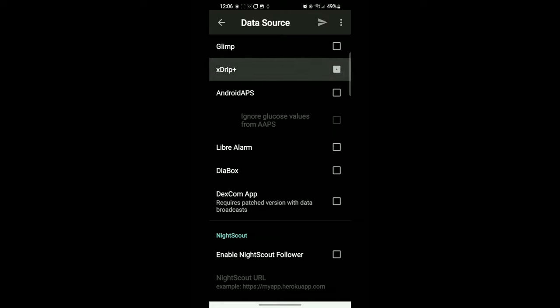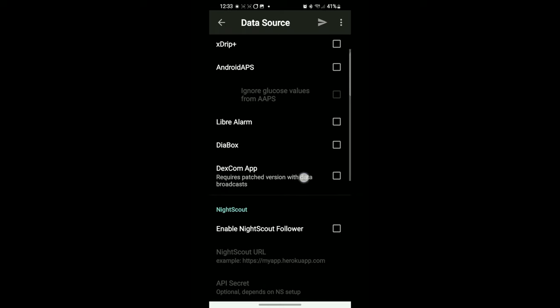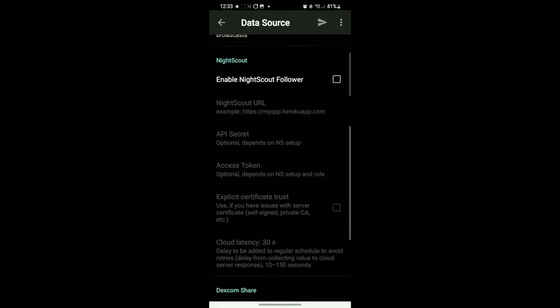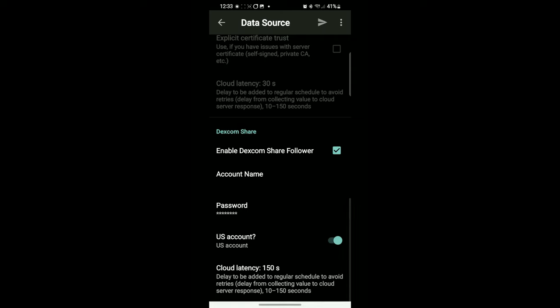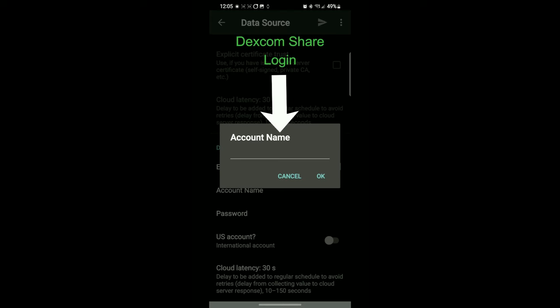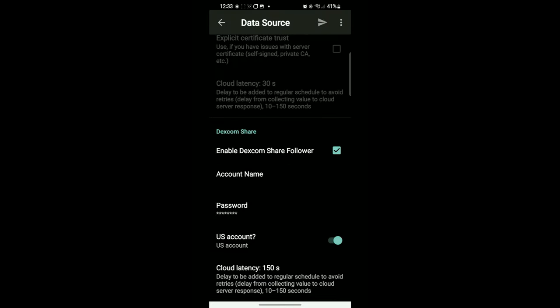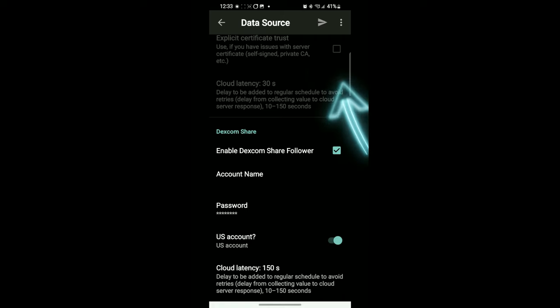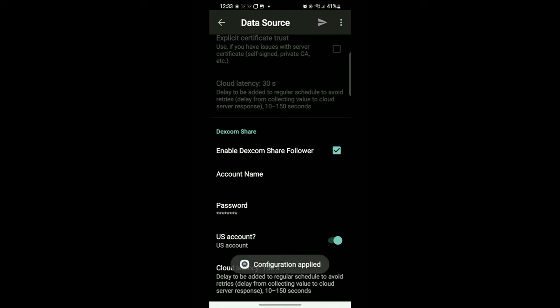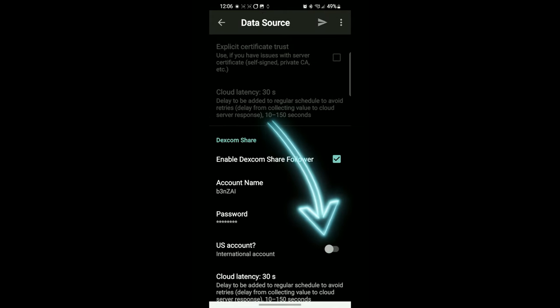You'll see Glimp and xDrip. You can go ahead and uncheck those. What we're looking for are the two Dexcom options. So there's Dexcom app, clicked on that one, and then enable Dexcom Share Follower. Then it's going to ask you to put in your account name. This is the same as your Dexcom Share login or your Clarity login. Put in your information and your password.